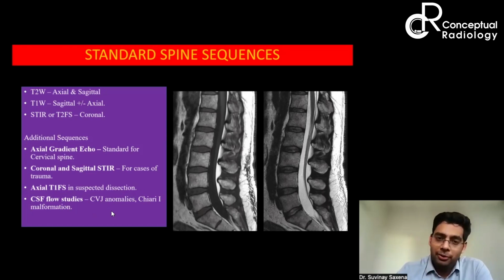देखो, most of you are now residents, but you are going to be radiologists in near future. For example, I give you a scenario. Right now you might be having technicians who are doing the MRI who are very well trained. If you open your own center, or if you join a corporate hospital, and then a technician comes who is not that well trained, right? And he asks you, sir, what is to be done or how it is to be done.